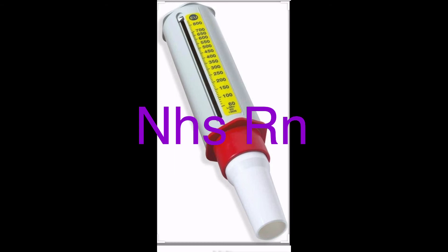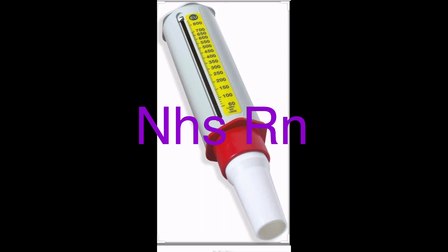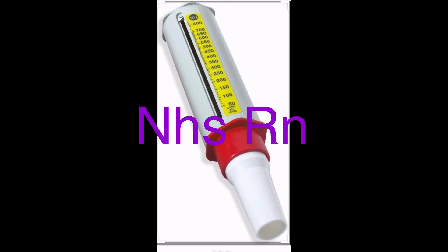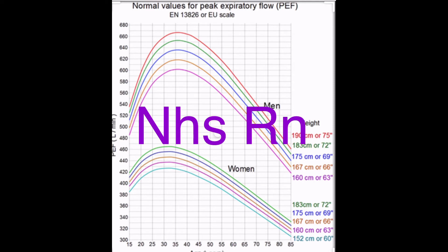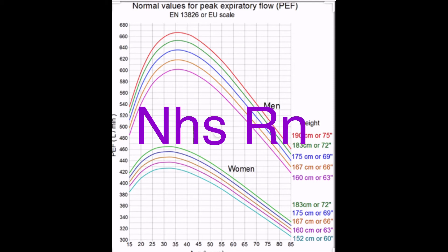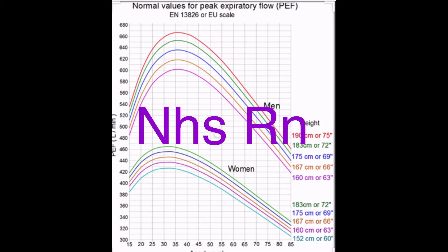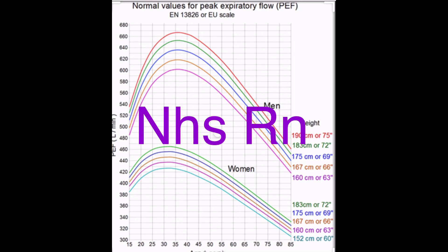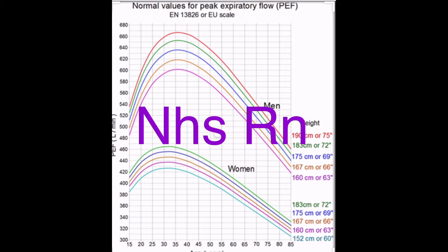When blowing into the meter, the patient should take a deep breath through their mouth and hold it for no more than two seconds. Then seal their lips tightly around the mouthpiece and blow into the meter in a short, sharp, forceful expiration — as forcibly as they can.